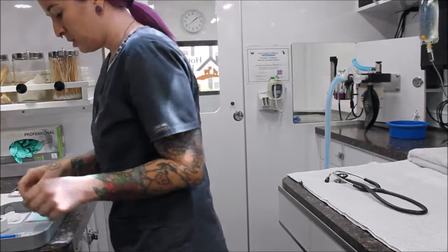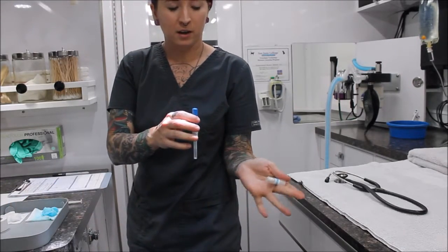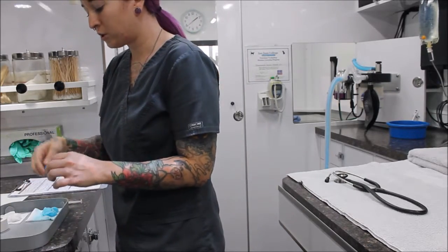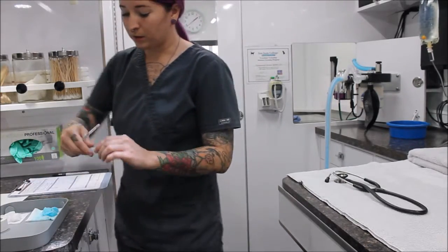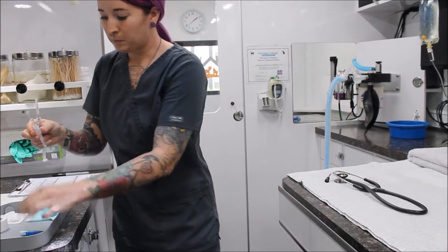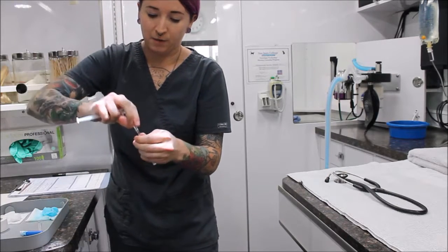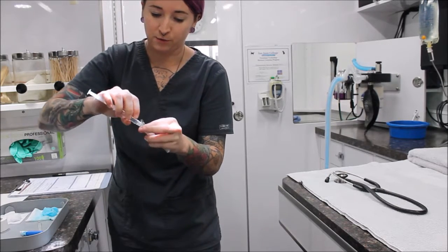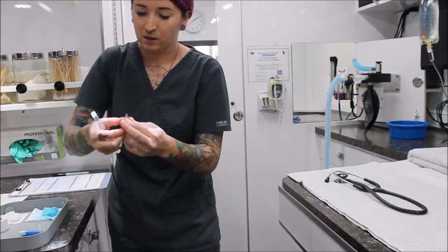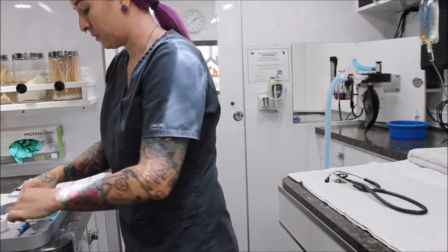So now what I'm going to do is just make sure that I have my IV catheter and an IV catheter cap, appropriate size for my patient, 22 gauge 1-inch catheter. And I'm just going to go ahead and open my catheter and take the cap off of my catheter, and we're just going to flush it with some of this heparinized saline solution. And I'm just going to place the cap back and place it back down here on the table.